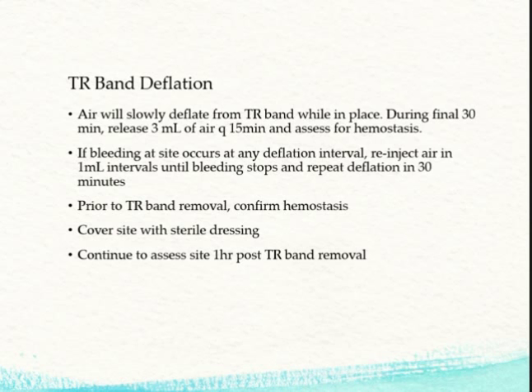If bleeding recurs, then you're going to re-inject air 1 milliliter at a time. So you put in a milliliter, see if that works. If it doesn't, give it a few minutes and put in another milliliter, until the bleeding stops. Then repeat the deflation process in another 30 minutes.